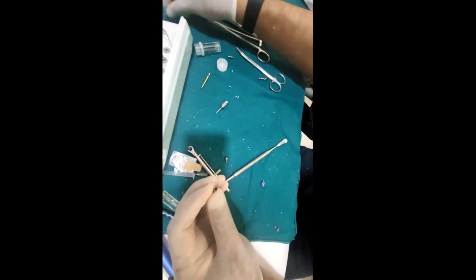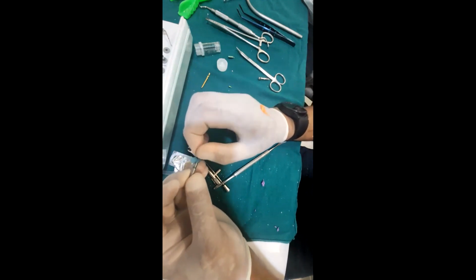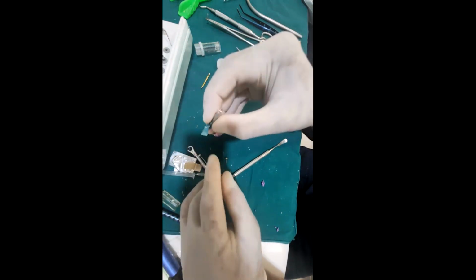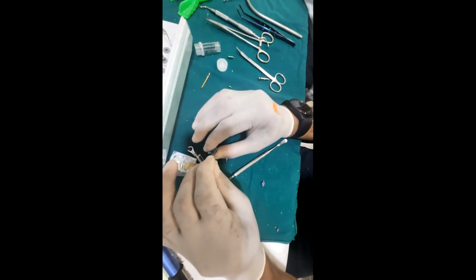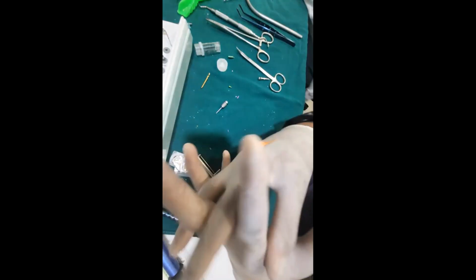As mentioned, this will be your lab analog. You place the lab analog in the impression coping in a particular direction as the geometry allows, and the lab will pour a cast and you will have a ready implant model over which the prosthesis will be designed.